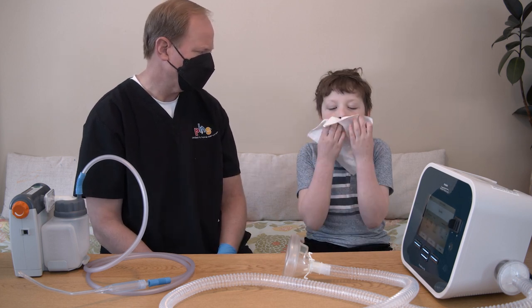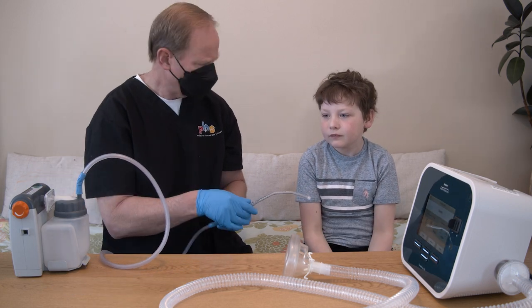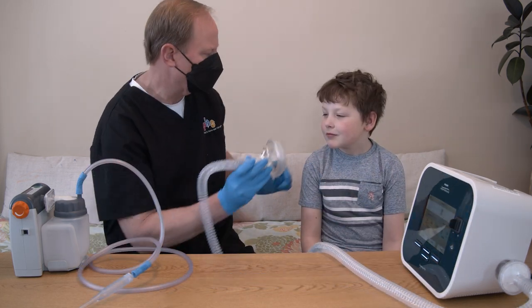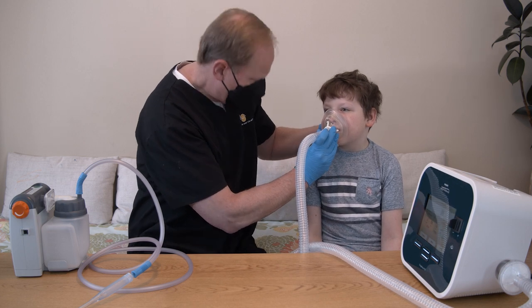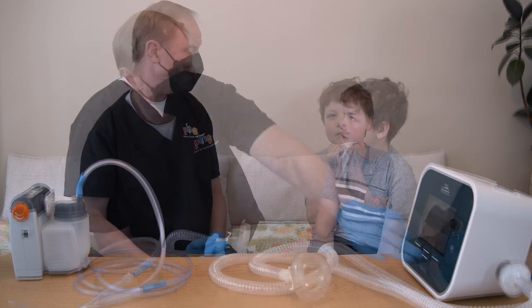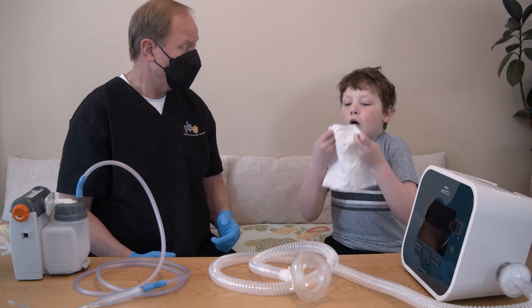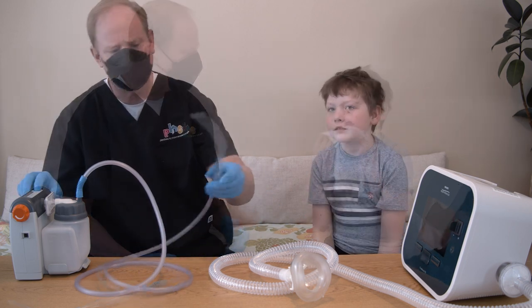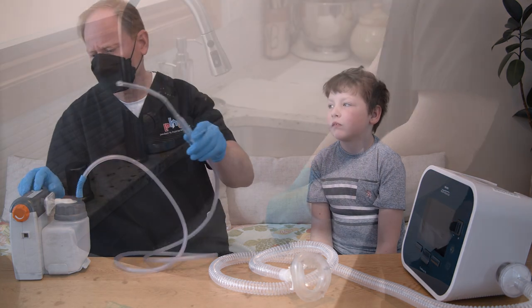Your child may cough or need to be suctioned during the rest period. Repeat the cycles, followed by a rest period, as prescribed by the healthcare provider. When the therapy session is complete, push the standby button, then turn off the device. Encourage your child to breathe deeply and cough if they can. Use the suction machine to clear secretions from the trach tube or back of the throat if needed.